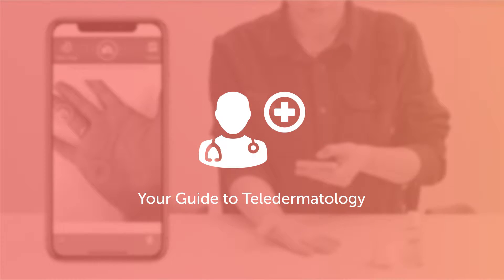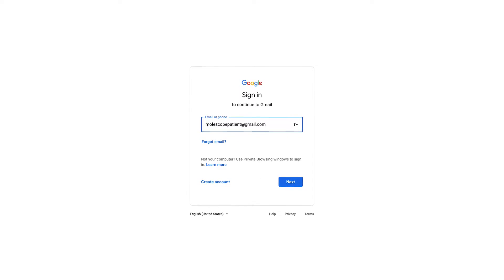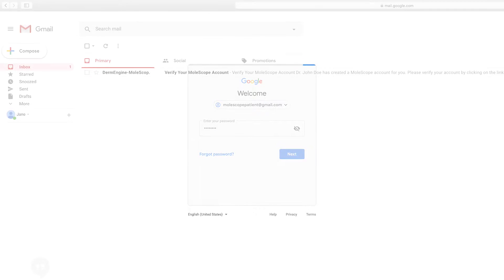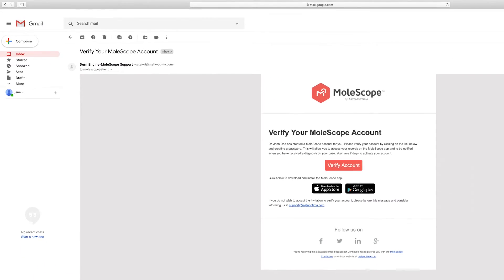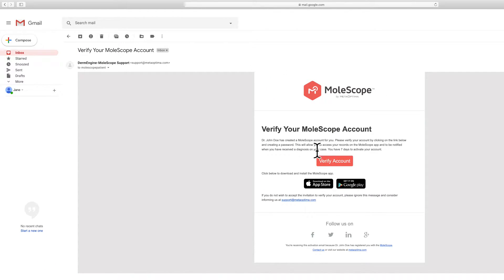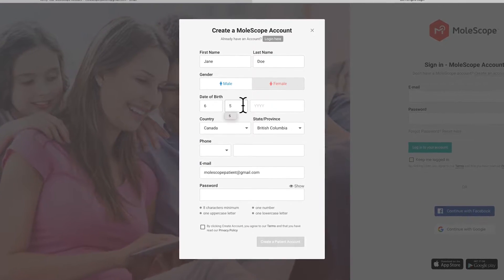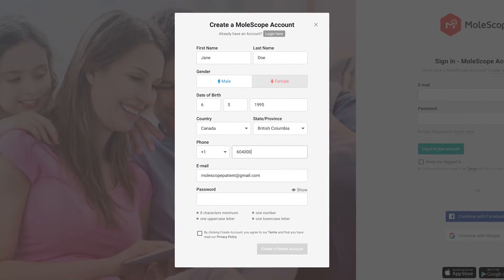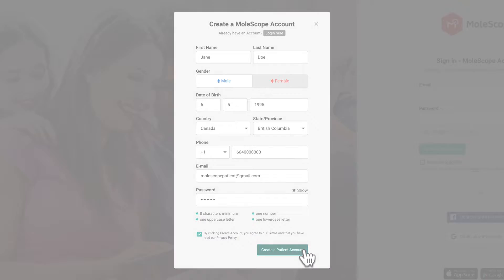Welcome to Molescope. Here's a quick guide on imaging your lesions and sending them to your healthcare provider for fast and effective care. In your email inbox you may have noticed that you've been invited to verify your Molescope account. Simply click verify account and complete the fields with your information and create a secure password. Be sure to download the free Molescope app and log in with your credentials.